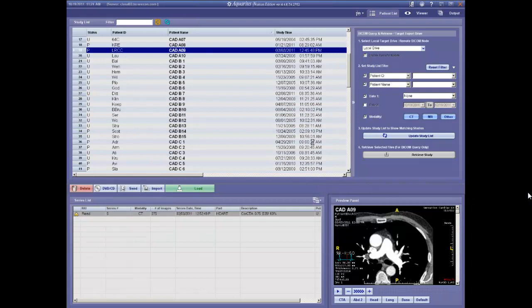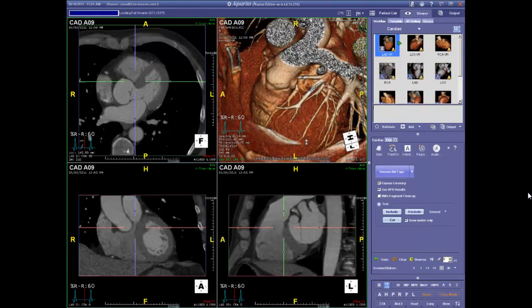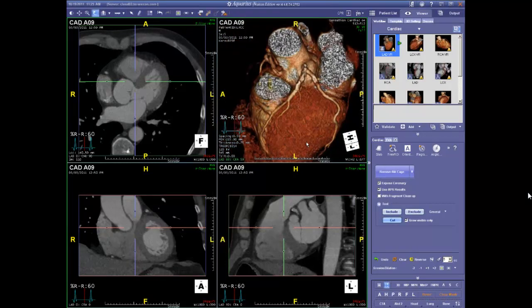information, but I do think it's very easy to correct misinformation. I'll tell you what I'll do. I'm actually in the process of loading this case back up, but that's a great question. Let me just roll it over to the next case, and we'll do some correction on the next case and show how that can be adjusted.